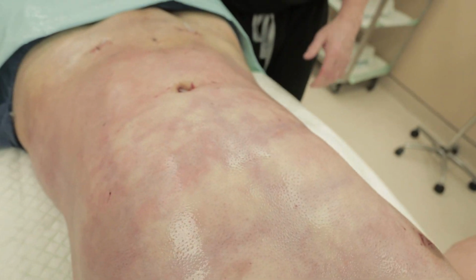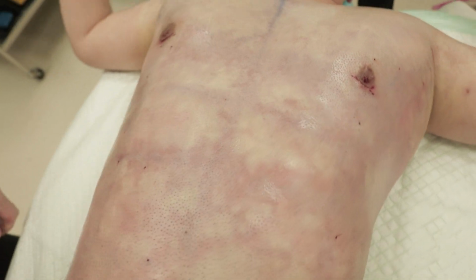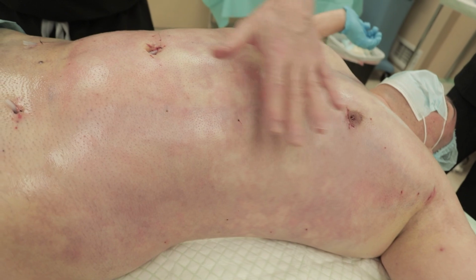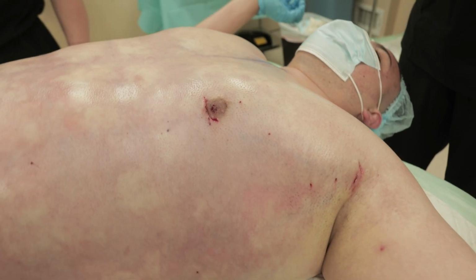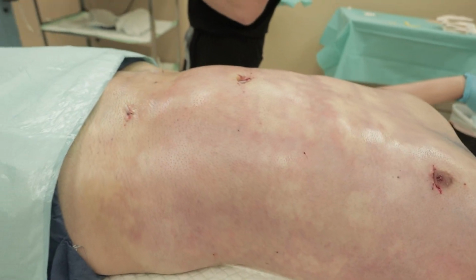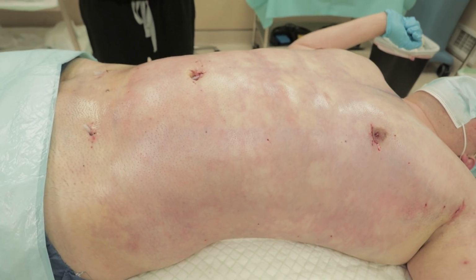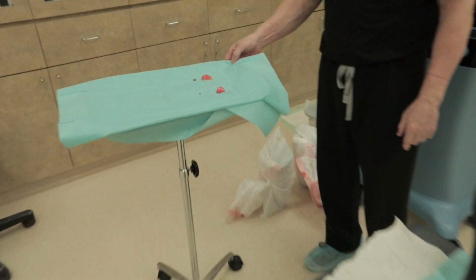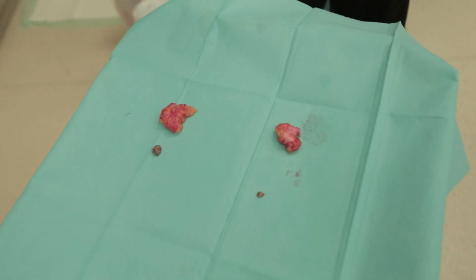Now again, sucking your belly there, that six-pack that we created, 2, 4, and 6, and the horizontal inscriptions that we defined and contoured all the way down to the hips and the lower back. Look at the negative space between the pecs and the lats. This is done with perfection under local anesthesia, and we did Renuvion J plasma to tighten everything up again through these same stealth incisions. We got out almost 6 liters of fat from all the different areas that we did, and the glands and the nipple that we removed were not that big. But the right side nipple was a lot bigger than the left side nipple. So we did both nipple reductions, gland removal, we did it all.